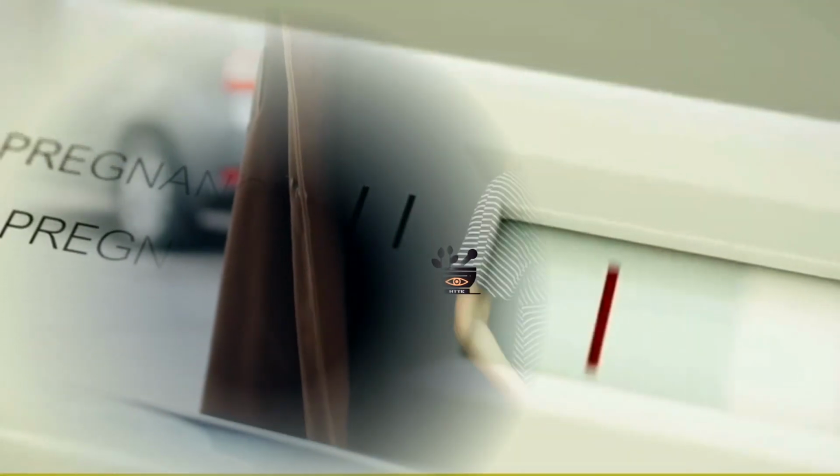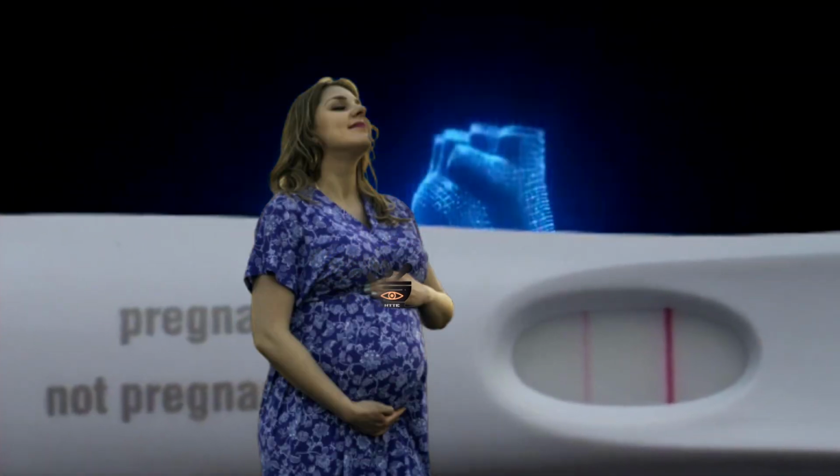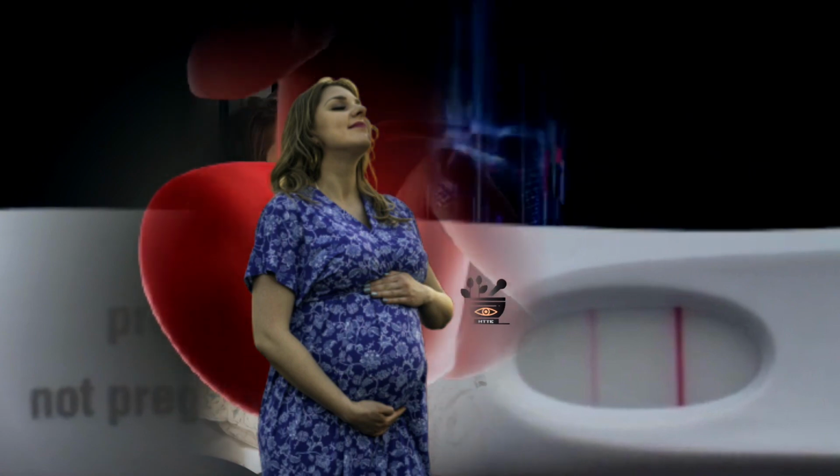What are evaporation lines? Well, they are a common occurrence on pregnancy tests and can sometimes be mistaken for positive results. Evaporation lines are caused by the urine on the test drying out, which can result in a faint line appearing on the test, even if you're not pregnant. Recognizing evaporation lines can be challenging. They often appear as faint lines, usually in the test area.